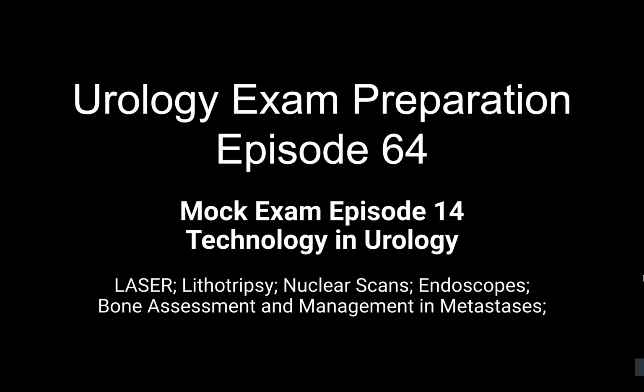Tissue interaction, your explanations are good. Now, the main role of holmium for tissue interaction in anatomic endoscopic enucleation of the prostate. See, again, I'm bringing down the terminology. Bring in as many keyword terminologies as possible. That's very important. In anatomic endoscopic enucleation of prostate, the key use is only hemostasis. With the help of the cystoscopy beak itself, you will be creating a plane physically, and if there are any obvious vessels or bleeders, you will use it for hemostasis. So that's the main advantage.